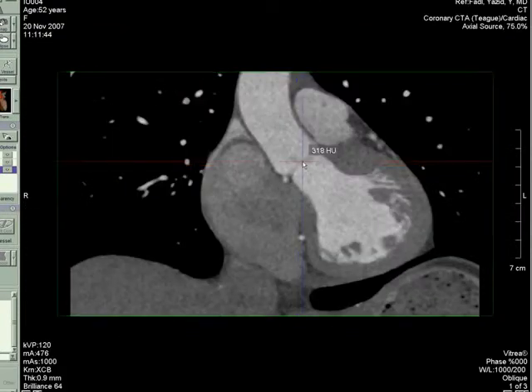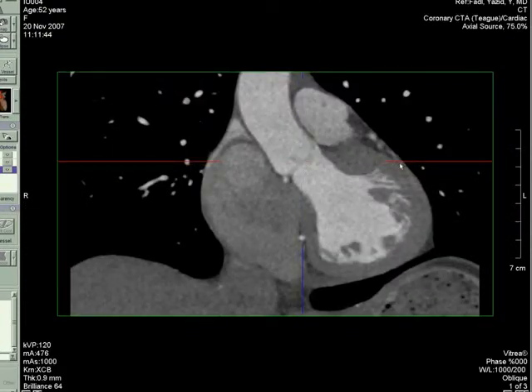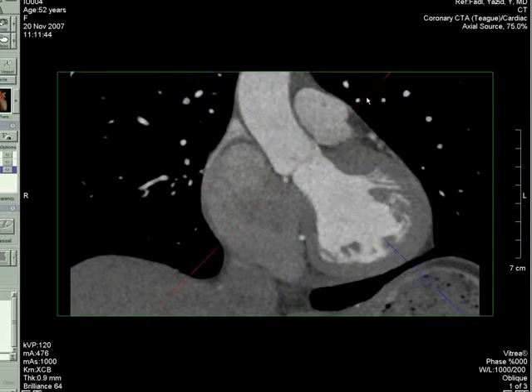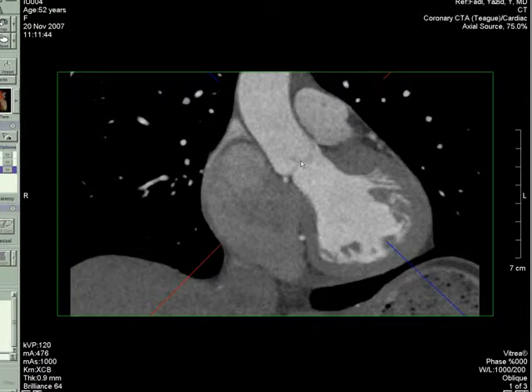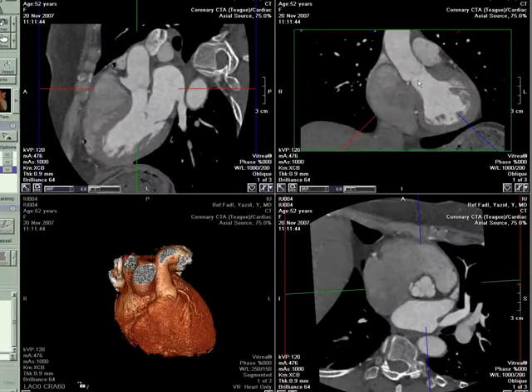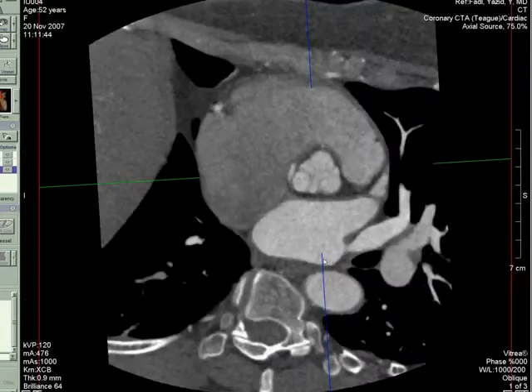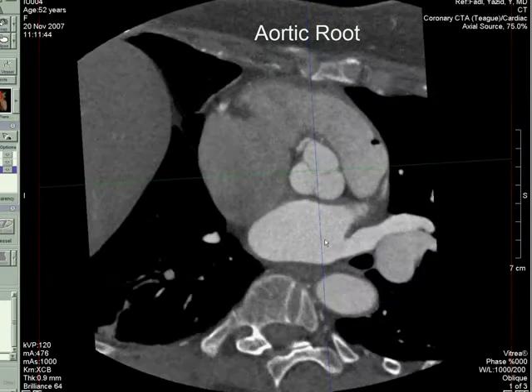So now I'm going to take another plane that's through the aortic root. I'm going to double oblique through the aortic root so I can see how the coronaries are coming out. And from this view here, I get our aortic root view as we magnify it up here.